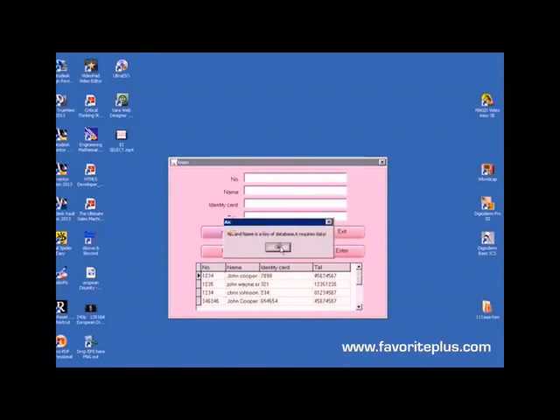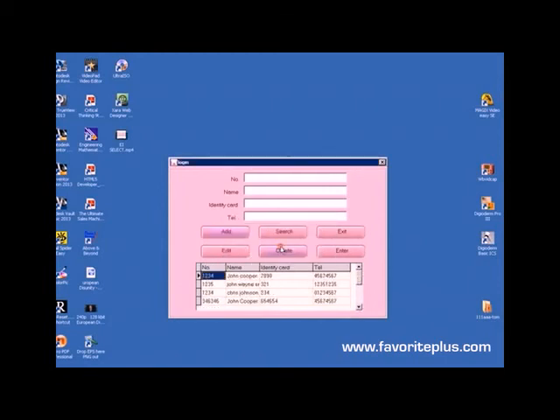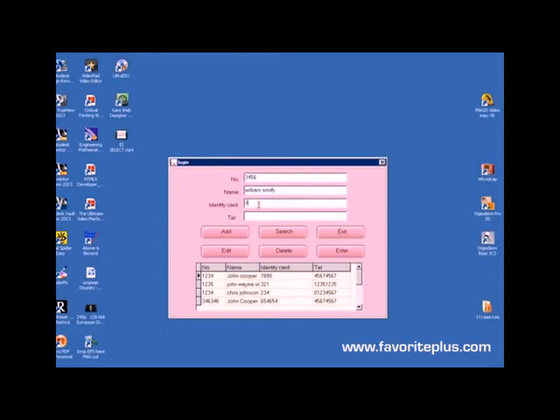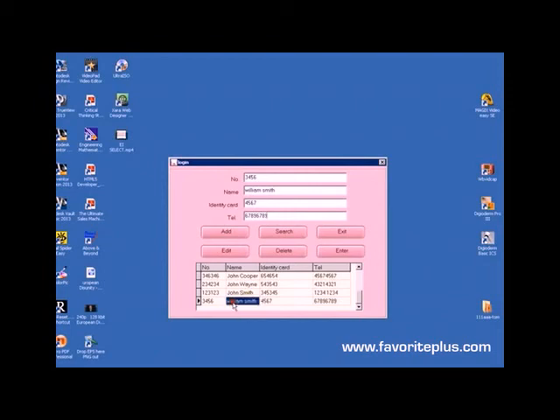Now, if you want to add a patient to this, let's put in, for example, his medical care number 3456. We can just put in his name William Smith, his ID card, let's call it 4567, and his phone number 67896789, and add. You'll see he's now been added to the database.